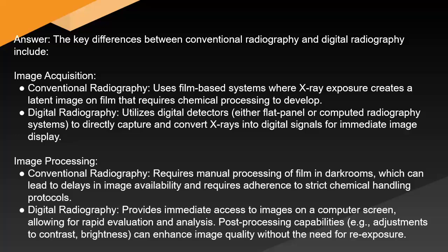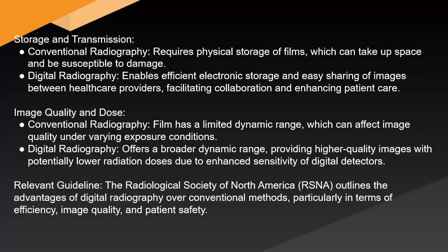Digital radiography provides immediate access to images on a computer screen, allowing for rapid evaluation and analysis. Post-processing capabilities, e.g., adjustments to contrast and brightness, can enhance image quality without the need for re-exposure. Storage and transmission: conventional radiography requires physical storage of films, which can take up space and be susceptible to damage.